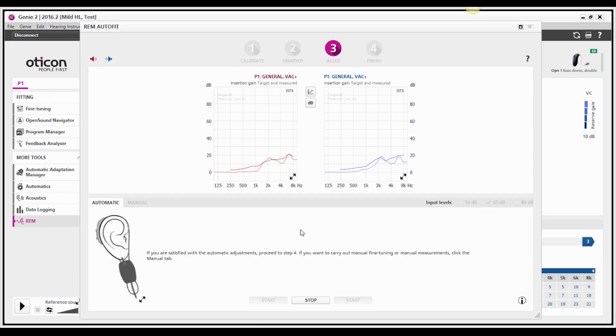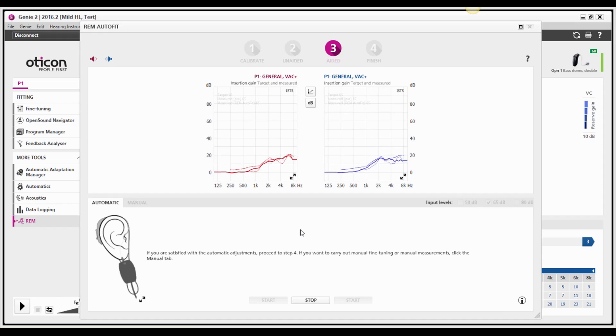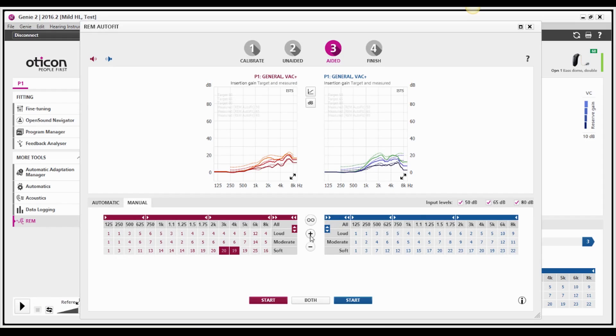Based on the aided measurements, the fitting software can automatically adjust the hearing aid gain to match targets, so you don't have to. And of course you always have the flexibility to further personalize the fitting through manual fine-tuning and verification, all within Genie.